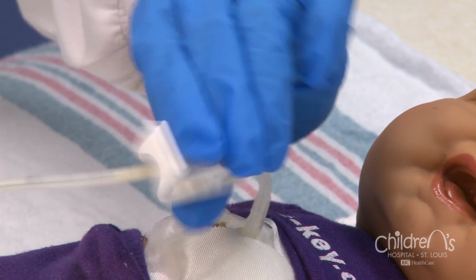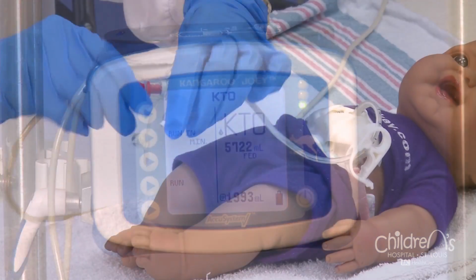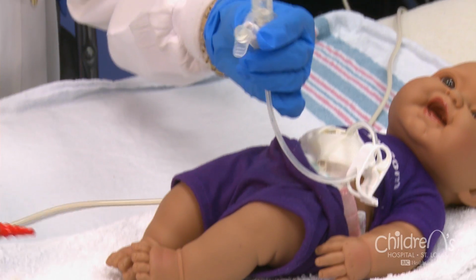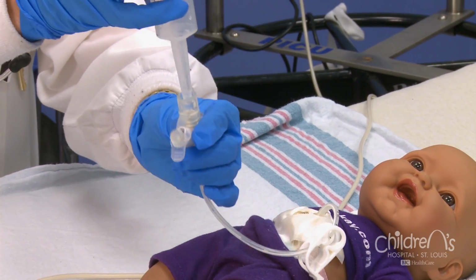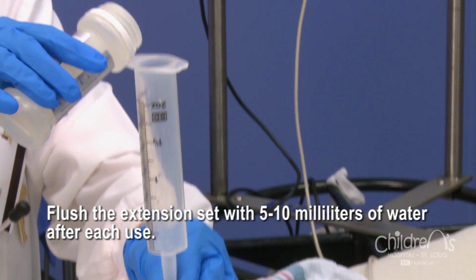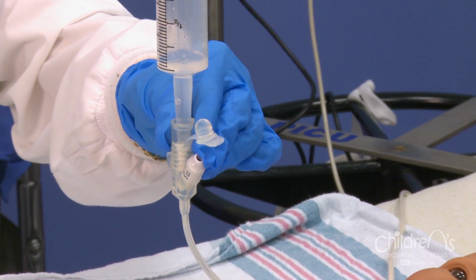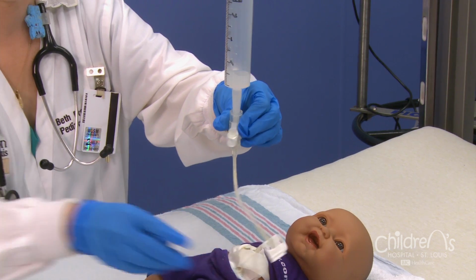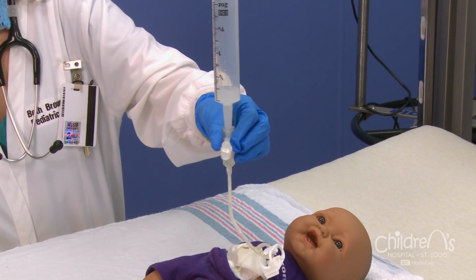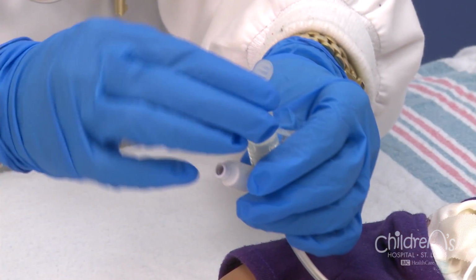Clamp tube set at the end of the feeding. Turn off the pump. Remove the pump tubing from the tube and attach the feeding syringe to the tube. Pour 5 to 10 milliliters of water in the syringe. Open the tube clamp if present and allow water to flow in, and then clamp the tube. Finally, place cap or rubber band on the tube.